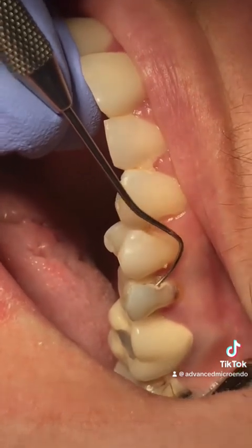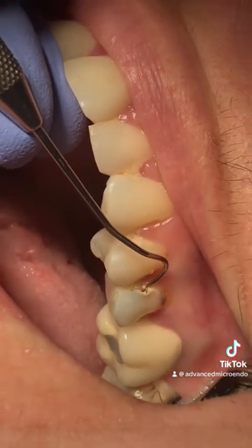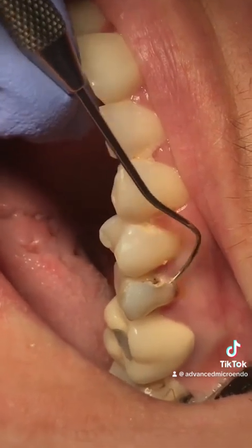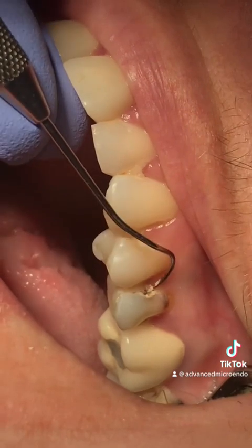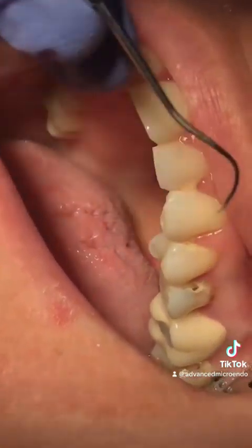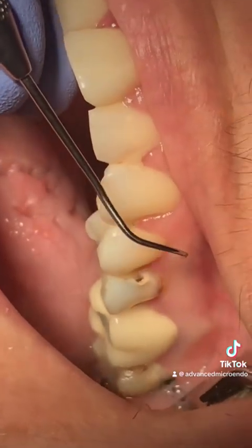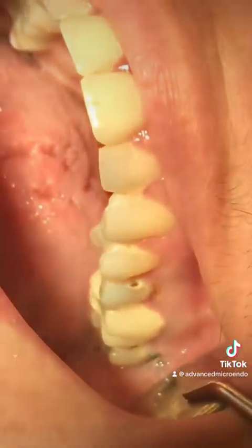And look, there's a big catch, and there's decay. This is decay. Right there, there's a hole right here. No, there's a hole here. If you come from the top, you see it. Right there. That's tooth number 13.